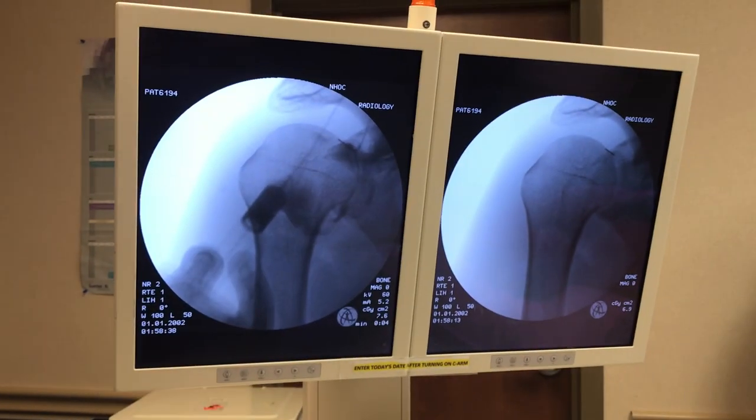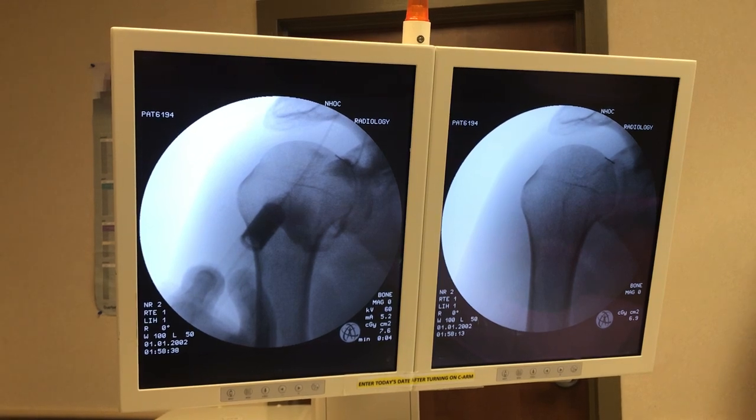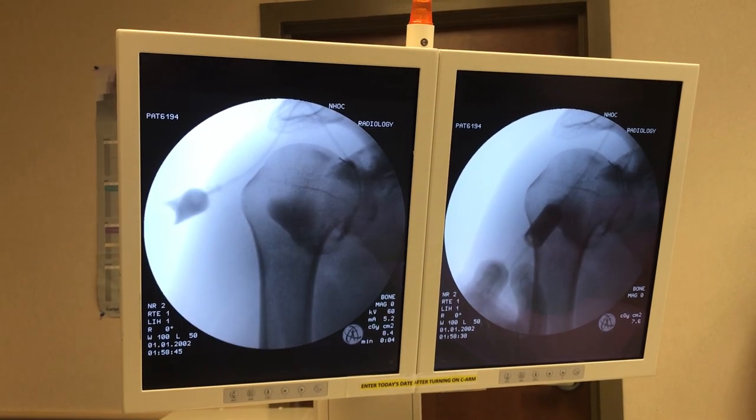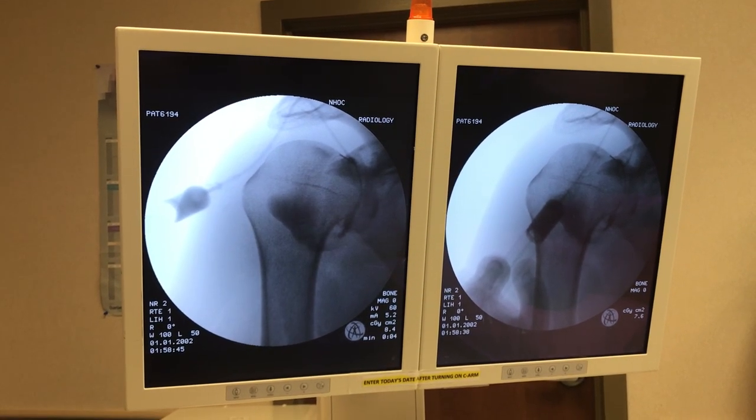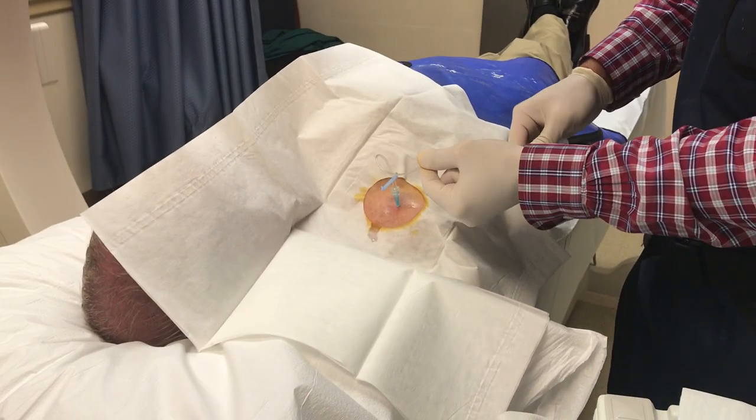We'll take an X-ray there — and we'll take one more X-ray. You can see a nice dye pattern lining the capsule, so we know we're inside the joint now.